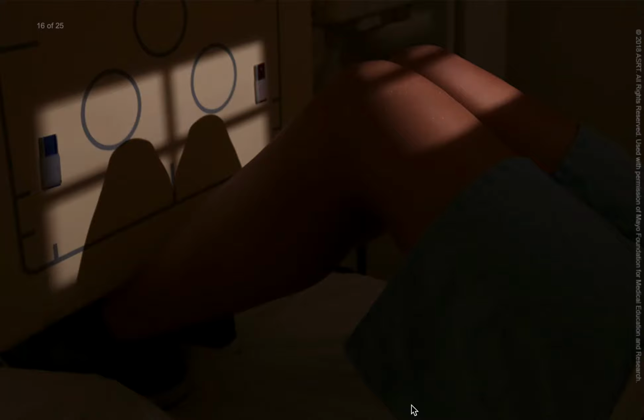Anatomical markers are placed on both sides of the image receptor to identify the anatomical sides being examined. The patient's gonads are shielded, with the shield placed between the X-ray source and the patient. The patient is instructed to hold very still, but no breathing instructions are necessary.